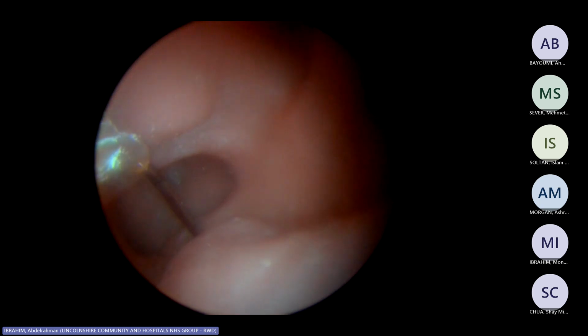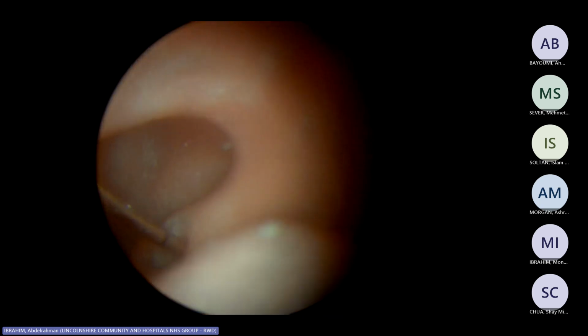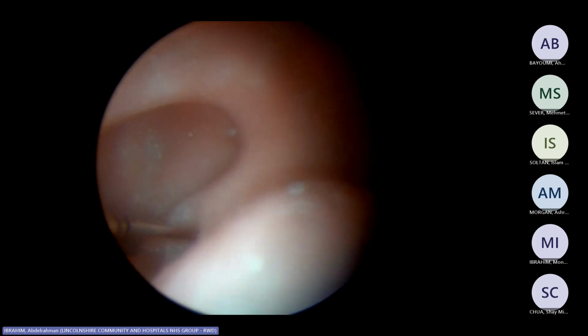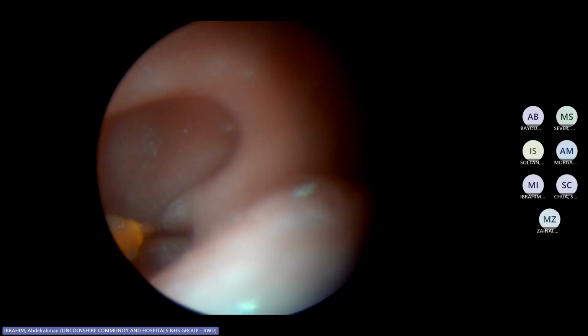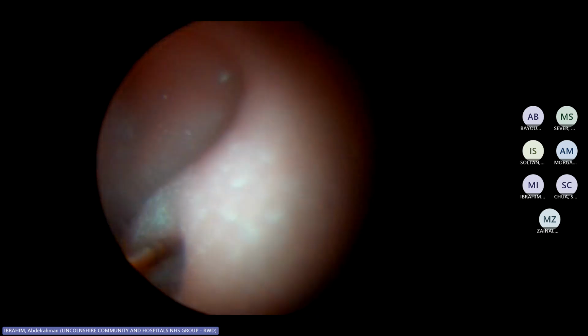Okay, so touch the edge as I said, and go up. You see, I'm turning. Once I hang this on the top here, I'm turning the edge and then going smoothly, until you get to this and you can see the mark. Exactly. Once it's there, he will advance the balloon.